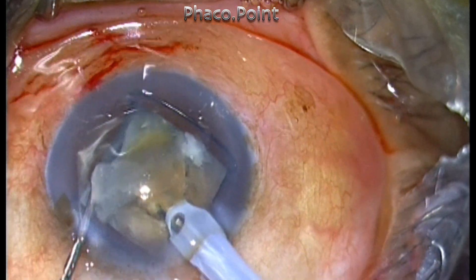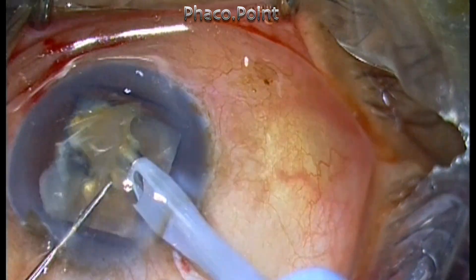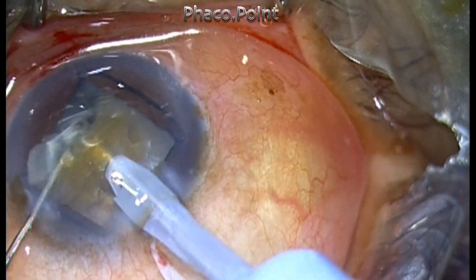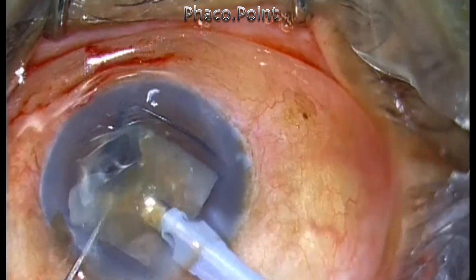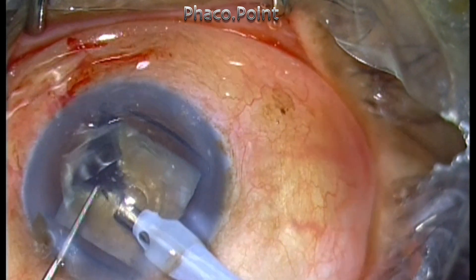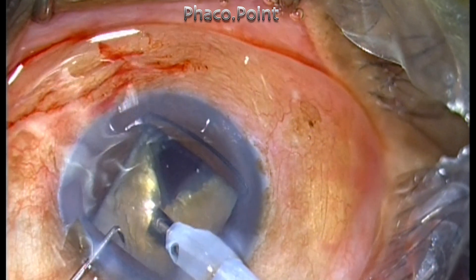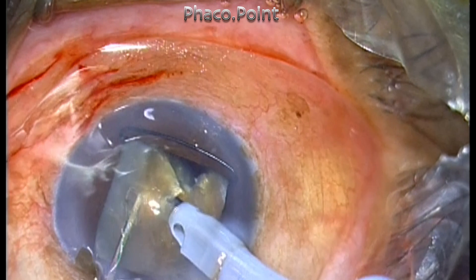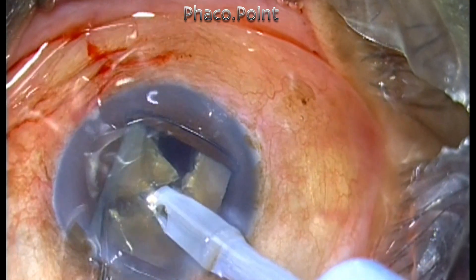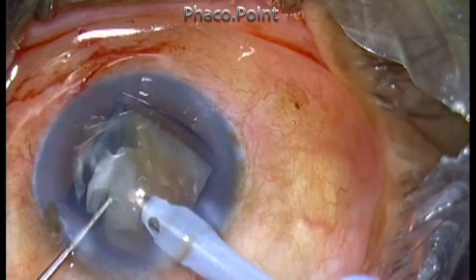I thought I'd broken off a small piece, but because of the large mass of the lens, even a small piece once mobilized looks pretty large. The sequential phaco chop has the advantage that there is only one piece in the anterior chamber at a time, greatly minimizing the amount of fragments flying around. However, while performing the second chop, I did not carry it through and through.